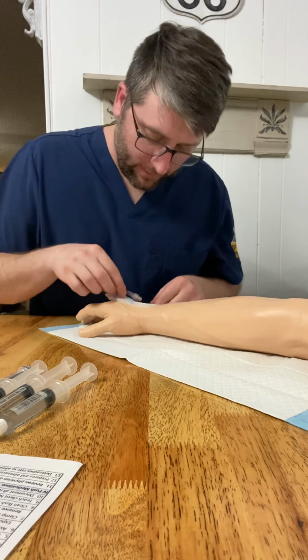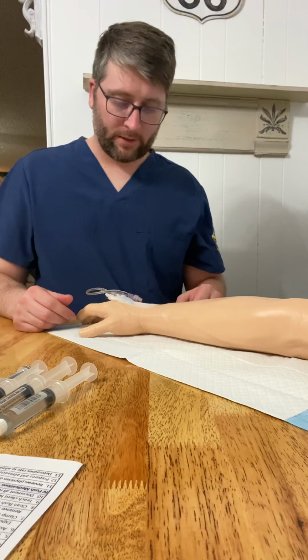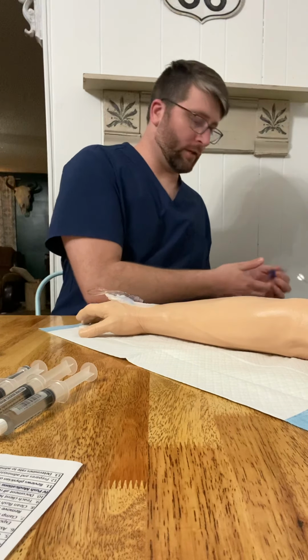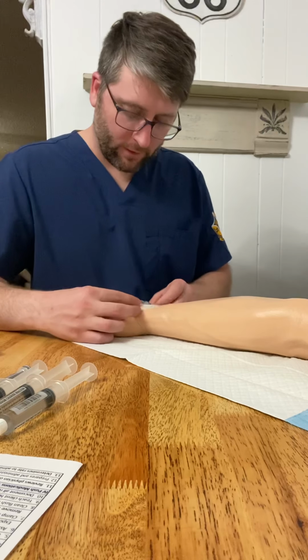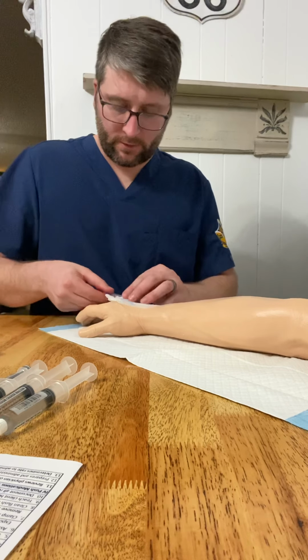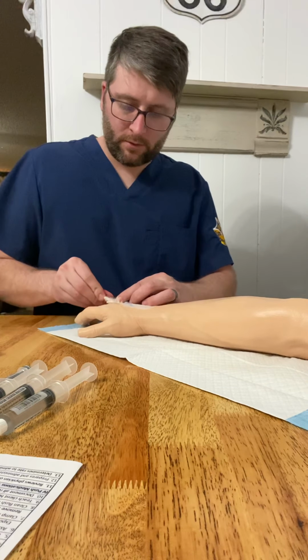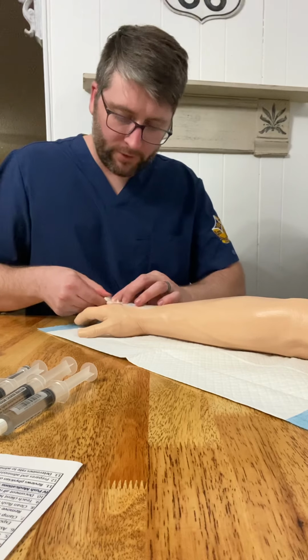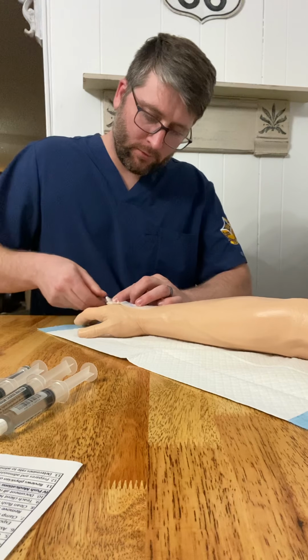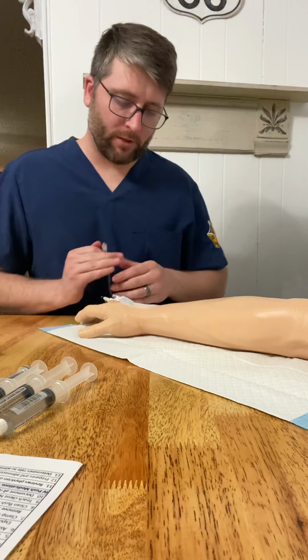We are now going to assess the IV site and make sure it is patent, that we don't have any other problems. We're going to clamp off our IV at this time. We are going to loosen our IV tubing. There we go, it is clamped. And we're going to disconnect that. We're holding pressure down on that catheter, ensuring that we don't pop that out.